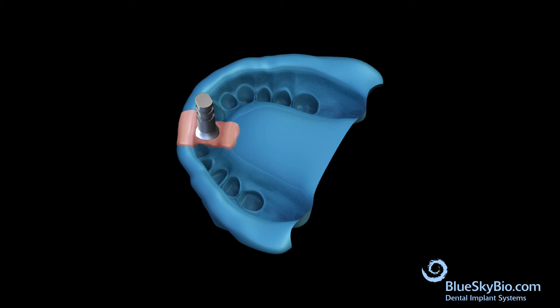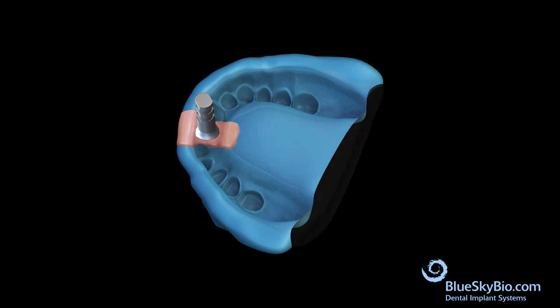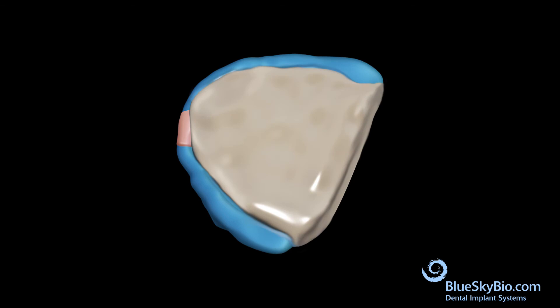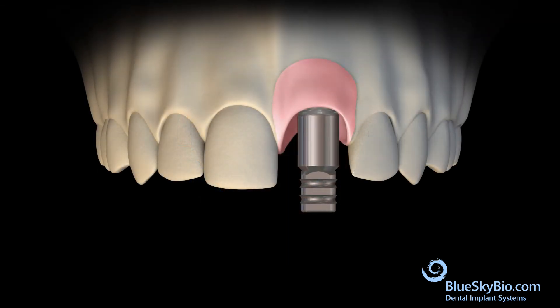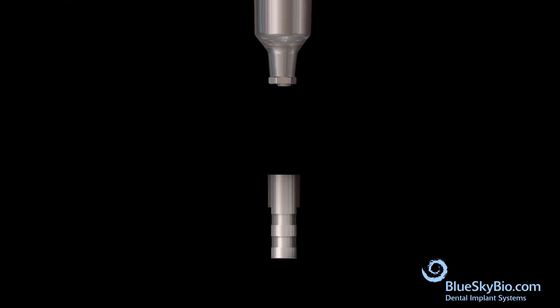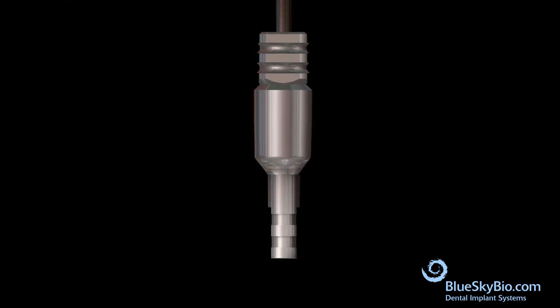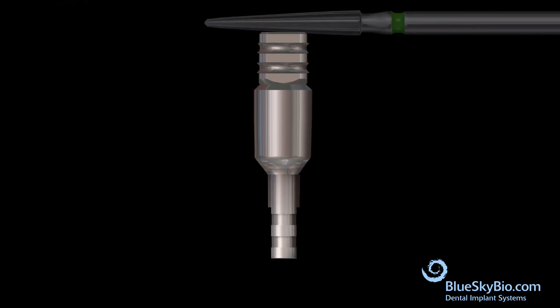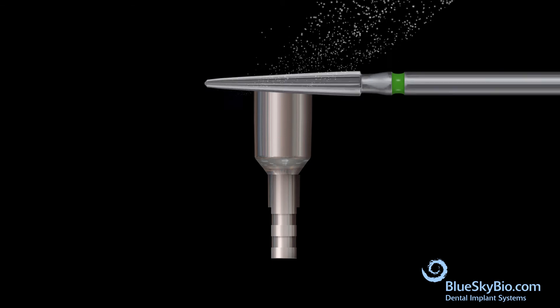Inject thin soft tissue model material around the analog, then pour model stone into the impression so a model is made. Remove the multi-purpose abutment from the stone model and attach the multi-purpose abutment to the analog.